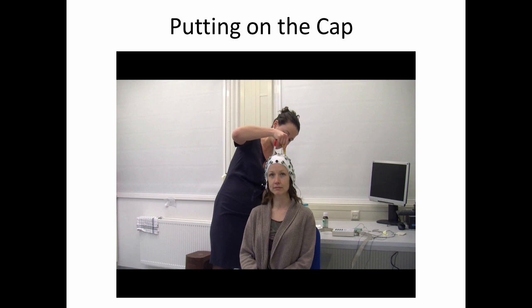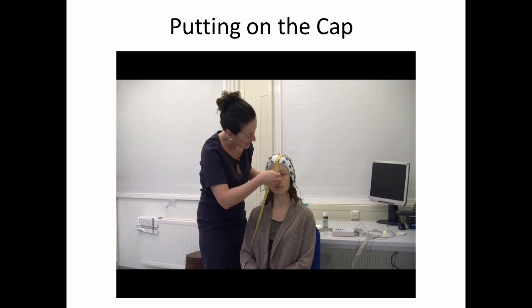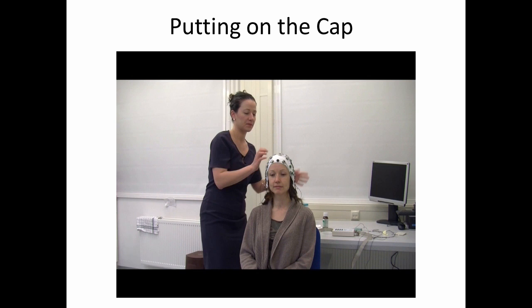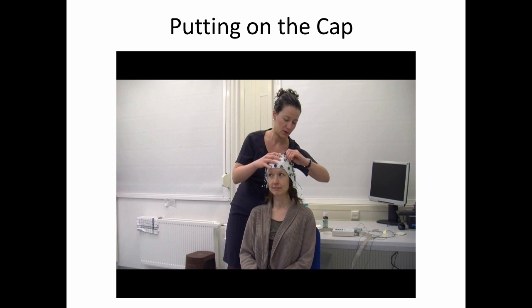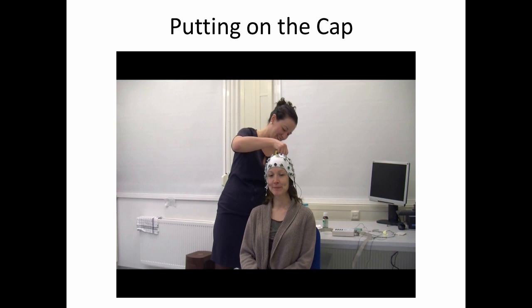Once the subject has signed the consent form, we go ahead and put on the electrode cap. Different subjects have different sized heads, and as a result we use different sized caps — the important thing is that the electrodes are in the same relative position for each subject. In order to make sure this happens, we use four different landmarks to center the cap on the person's head. In the forward to backward direction, we use the point between the eyes and that bump on the back of your head, which is called the inion. In the left-right direction, we use the midpoint between the two ears.